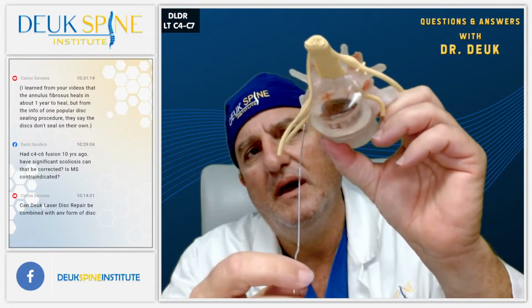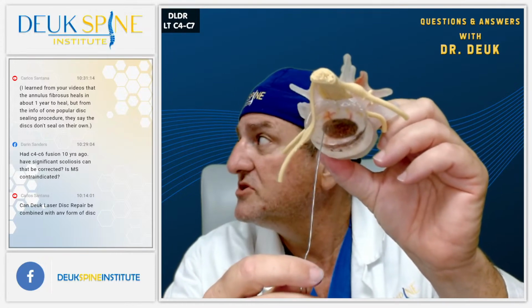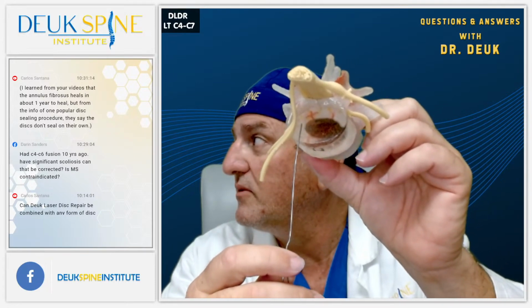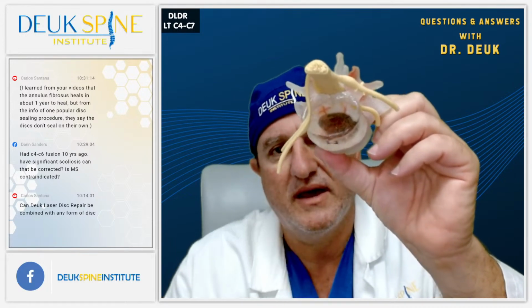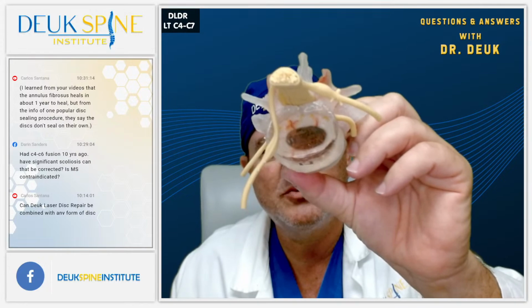2007? Okay. Look back here in the back of this disc. There's a little tear there. You see that red line there and there, the other side. Those are annular tears, folks. That's where the pain comes from.